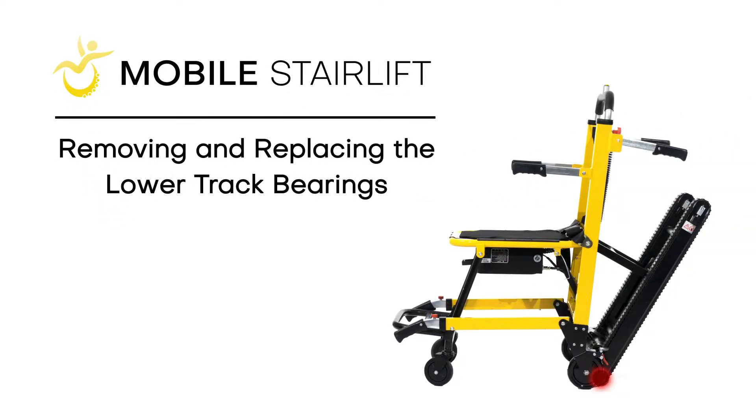In this video, you will learn how to remove and replace the lower track bearings on a mobile stairlift.